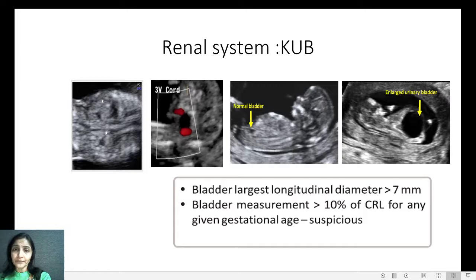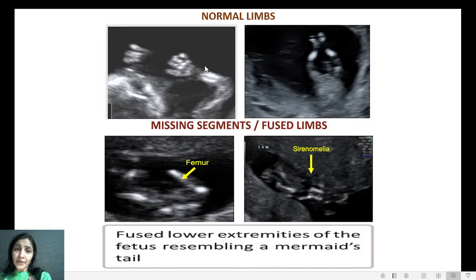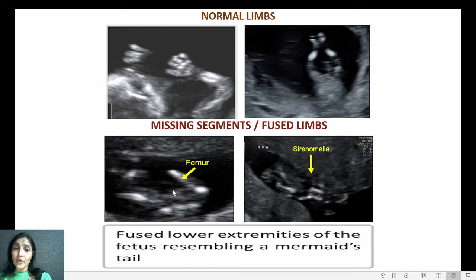Coming to the extremities section: we document both hands, if possible with open fingers, and both lower limbs. This helps exclude limb anomalies such as fused or mermaid limbs, absence of limb segments such as absent femur or radial ray defect, absence of digits such as oligodactyly, and extra digits such as polydactyly.